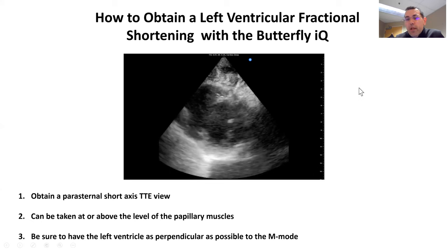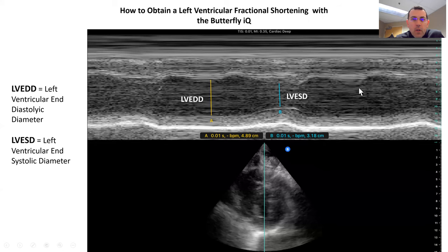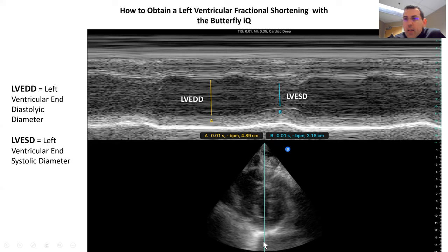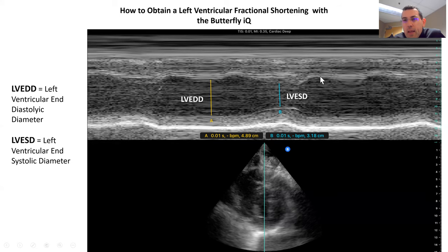Here we lined up our donut view — our parasternal short axis view — right in the middle of the screen. We put our M-mode on and have it coming straight down, right perpendicular through. What it shows us is contraction between the anterior and posterior walls, then a relaxation, then contraction again of the anterior and posterior walls, then relaxation, then contraction again.